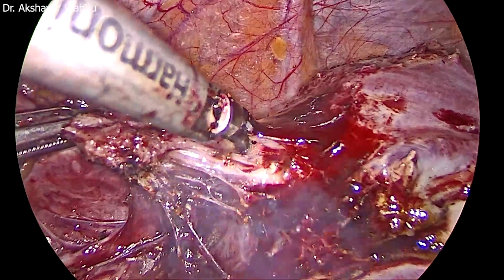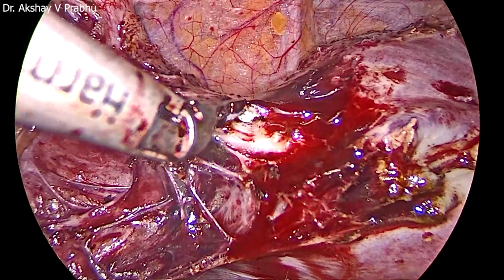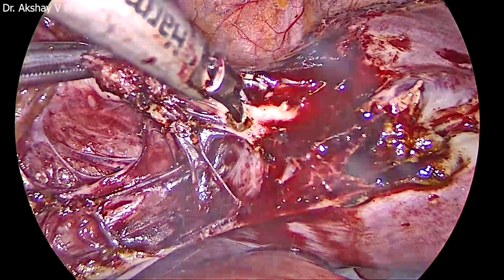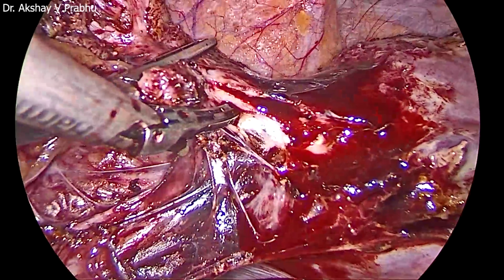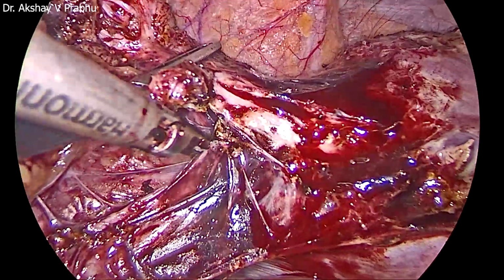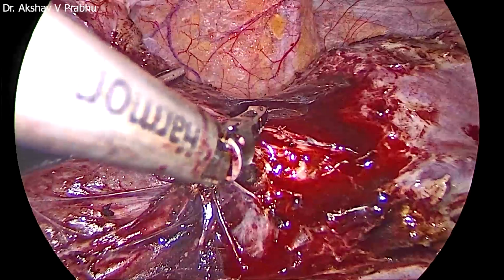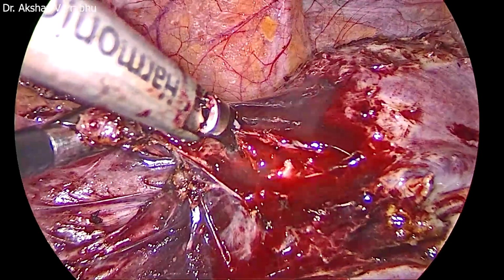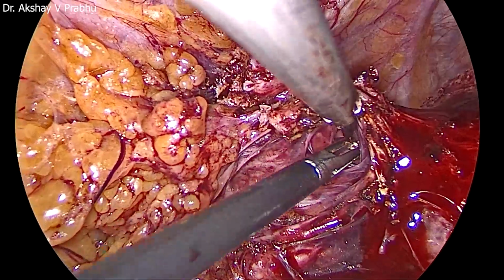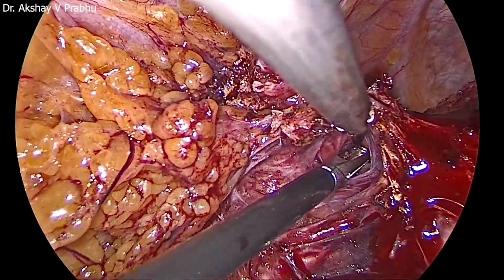As I always repeat in every video, whenever you cut any structure, always put it on traction, always put it on stretch. That keeps the vital structures away from your energy source. So now that's what I'm exactly doing. I have put the adhesion band along with the bladder on stretch, and I'm cutting it close to the uterus where I can feel the previous scar is.